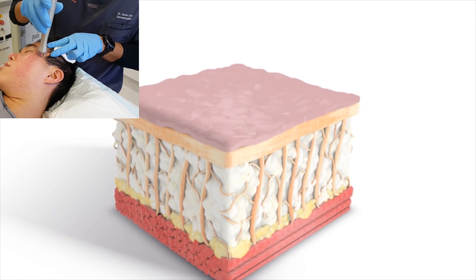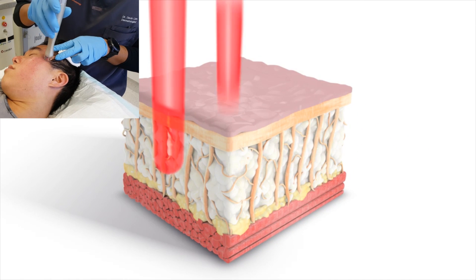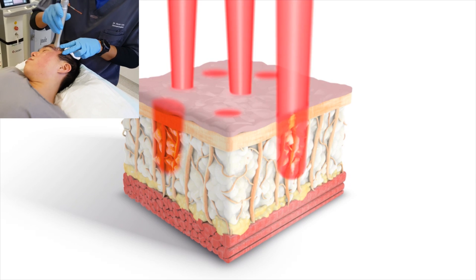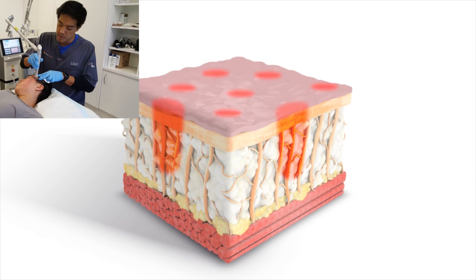Fractional laser resurfacing using different lasers and different wavelengths all work by the same principle. Basically, we're treating fractions of skin so that the remaining skin can actually heal up quicker.